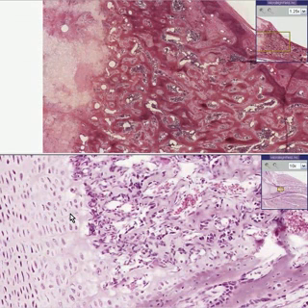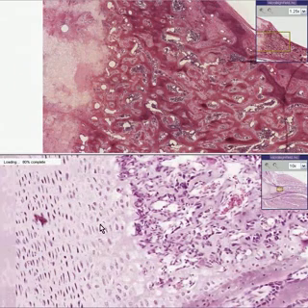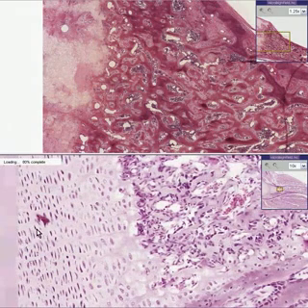You may have remembered from normal bone histology and physiology that the process by which bone is formed from cartilage, often occurring in long bones, is the classical transition from an area of resting cartilage to proliferating cartilage.